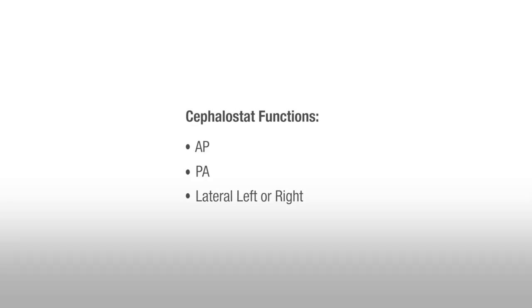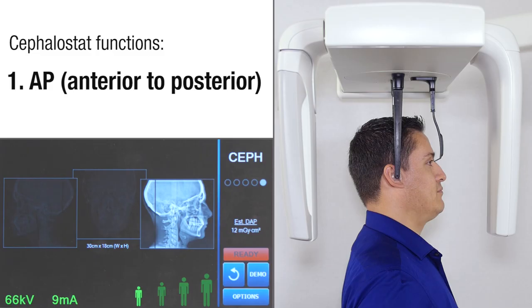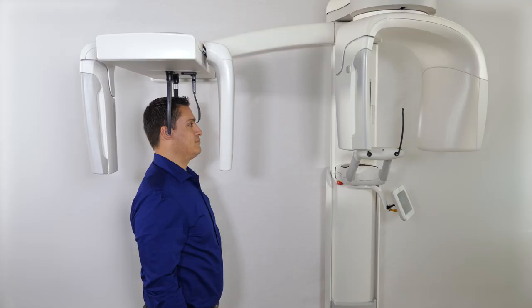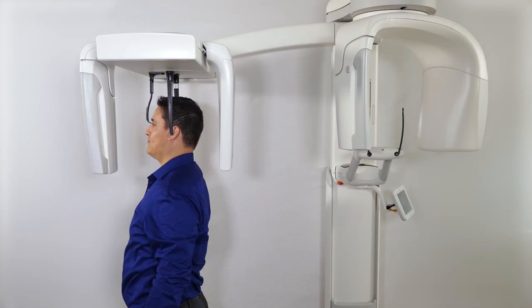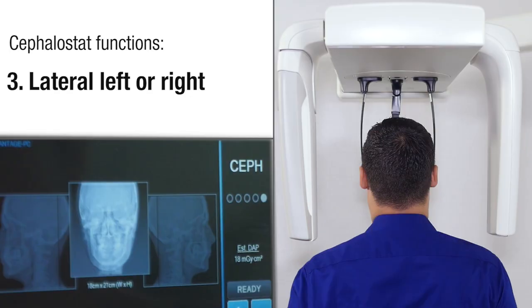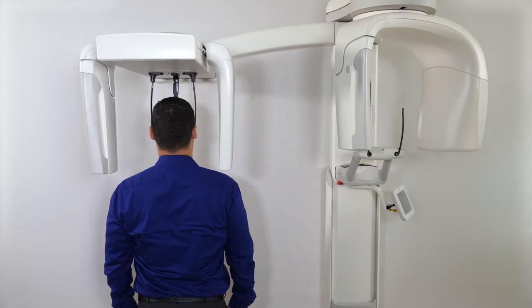Next, determine the CEPH study needed for the patient and select the desired function. There are three CEPH functions: the AP, the image taken from the anterior to the posterior of the head, or nasion toward the tube head; the PA, the image taken from the posterior to the anterior of the head, nasion opposite the tube head; and lateral left or lateral right. The otic posts are in line with the X-ray tube head.